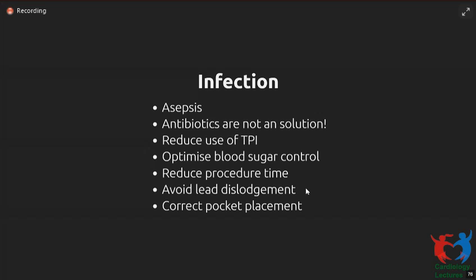And what I mentioned before, what looks like late infection, people come with erosion and then secondary infection after 2 years or 3 years after implant, usually because of bad pocket placement. So avoid that.